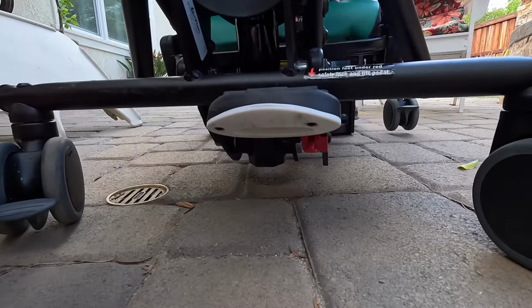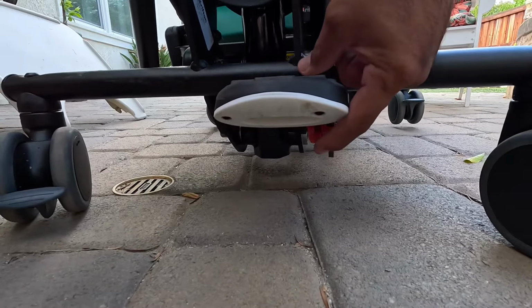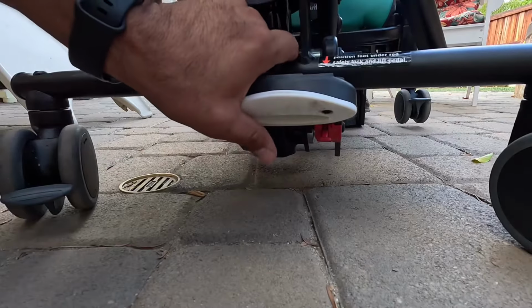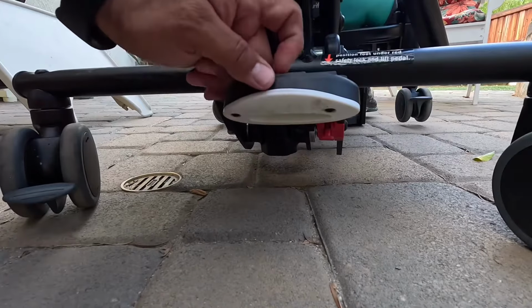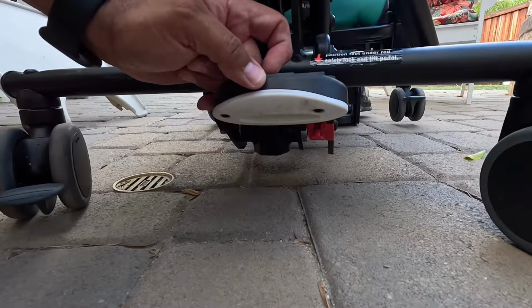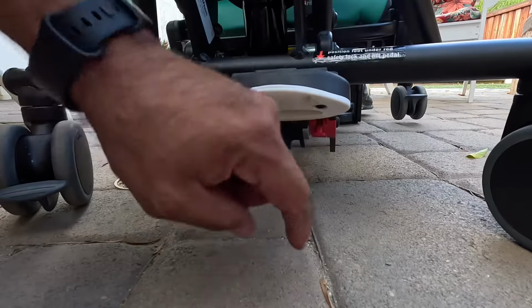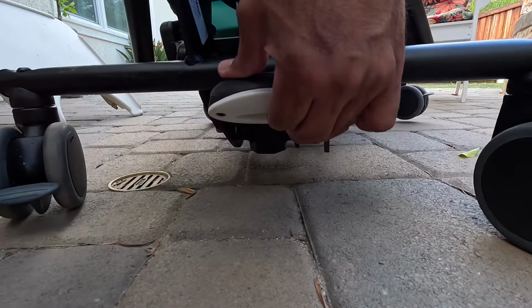It's important to see where this red trigger is because it is relevant when you want to drop all the way. When you want to just drop the chair to seating level from higher than seating level, you'll just lift up on this with your foot. And when you want to drop the chair all the way to the ground, so that Billy can get into the chair, then you will lift the white part of the foot pump, but also catch this little red trigger here, and lifting them together will lower the chair all the way to the ground.